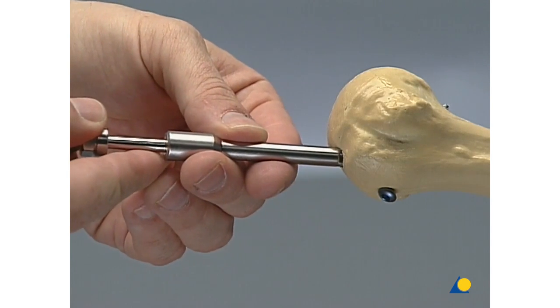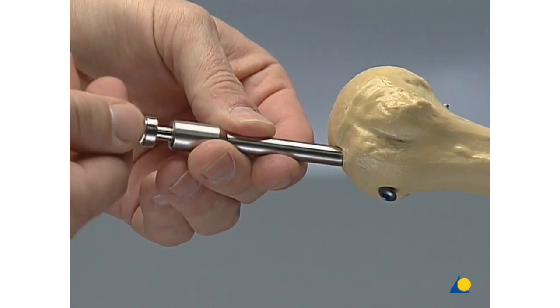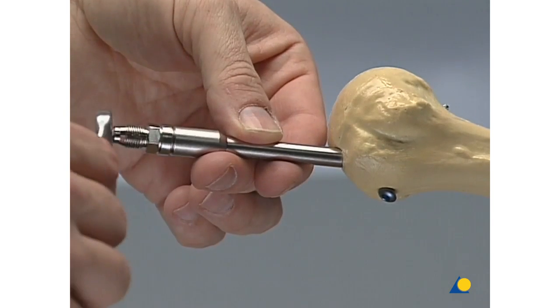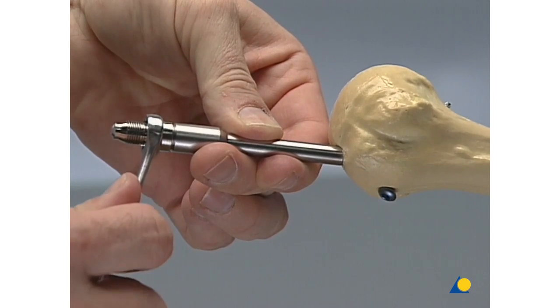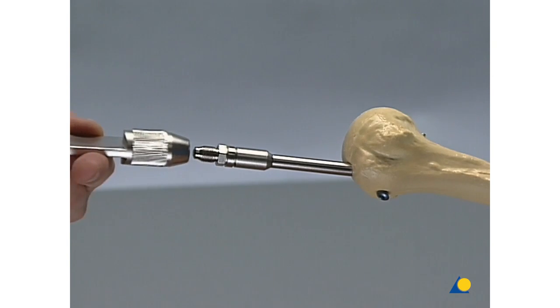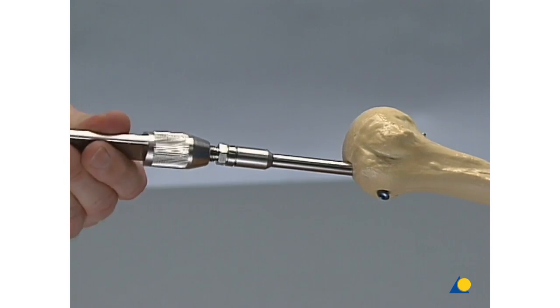Now, we screw the connecting screw and the coupling block into the proximal end of the UHN and tighten with the combination wrench. Finally, the inserter extractor is screwed onto the end of the connecting screw.